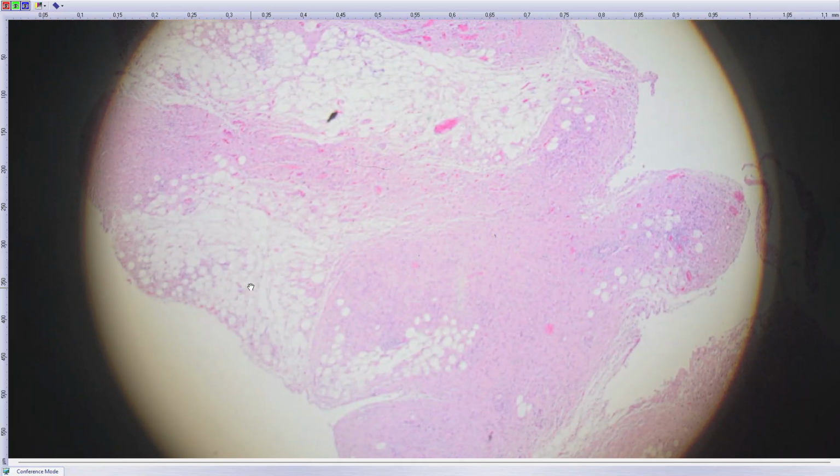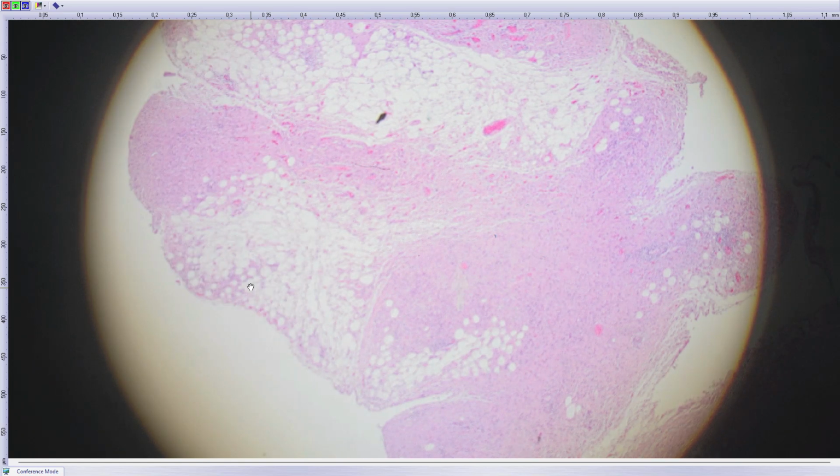He first had ischemic heart disease, and then eventually was found to have multifocal arteritis, so vasculitis basically of large vessels. And then he had some B-type symptoms, and eventually they found he has a peritoneal dissemination of some probable neoplasm.